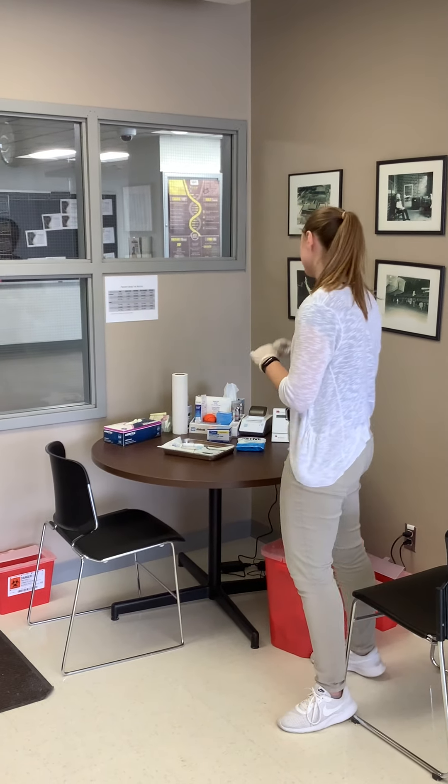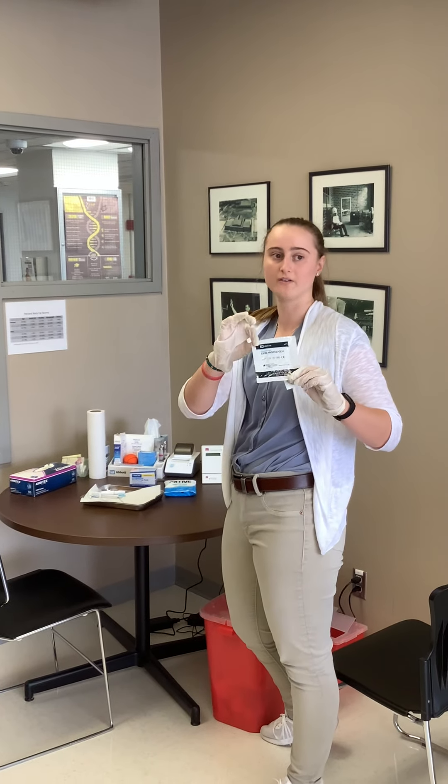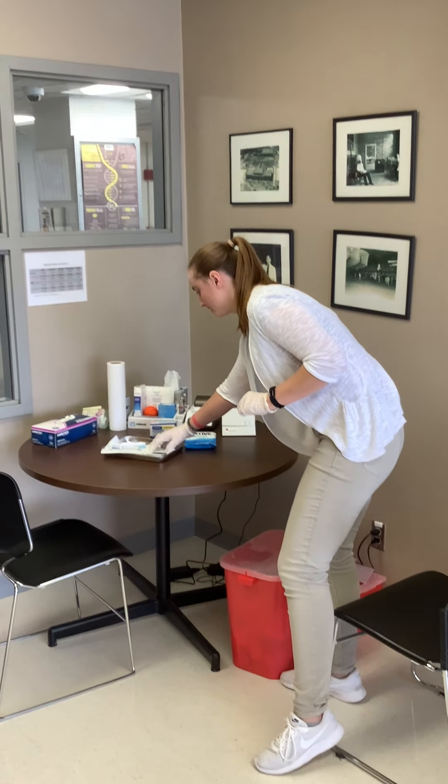We're going to be doing the blood lipid test. 30 minutes before your participant gets there, you're going to want to take this out of the fridge — it is the lipid cholesterol kit — so you're going to want to take that out before your participant gets here.